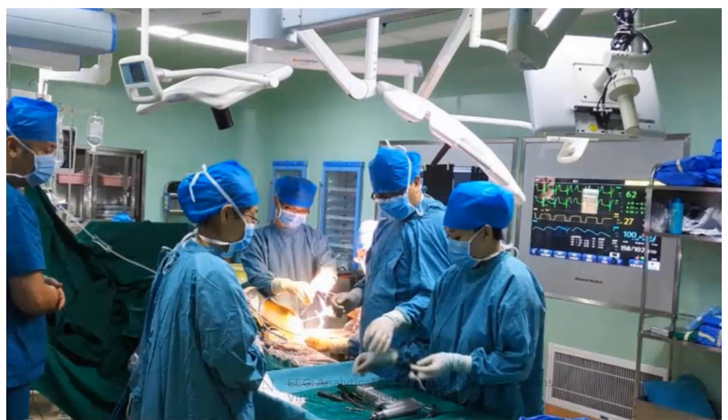But let's fast forward now to the modern and compare this to the modern surgical setting, where our surgical costumes are different. So we're no longer operating black tie like back in the old days, and we've discovered things like sterile techniques, so we use gloves and masks. But we also have advanced monitoring techniques. So we can stick pads and cuffs on people and measure their breathing rate, heart rate, and blood pressure in real time. However, we're still operating under 100-year-old assumptions that patients are not experiencing anything while under anesthesia if they don't respond to this painful stimulation of their procedures.